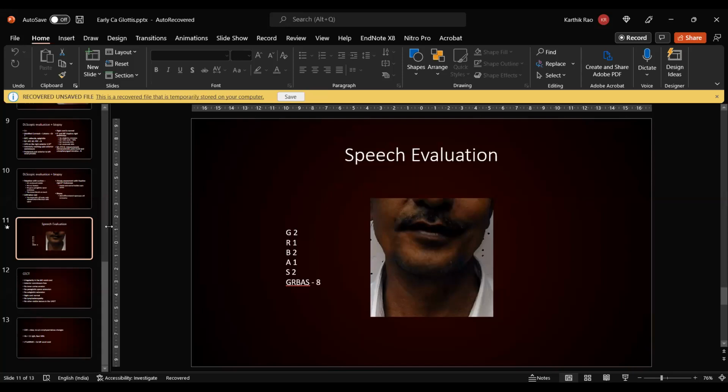And what are the problems with laser? Sir, there are patient factors, tumor factors, and institutional factors, that is, doctor and institutional factors come into play. I'm asking about the difficulties in laser surgery. Agreed, there are patient and tumor factors, but what are the difficulties in laser surgery? Sir, we may not be able to get adequate exposure. Exposure may be limited. Yes, sir.